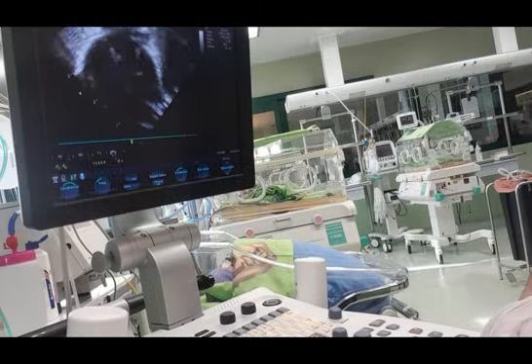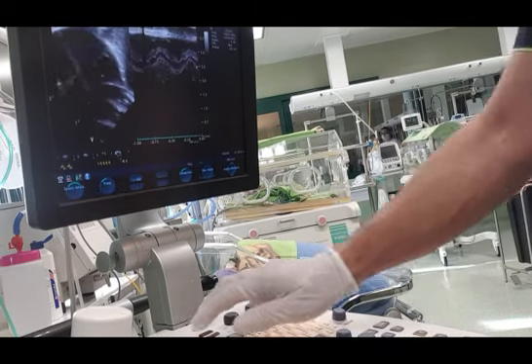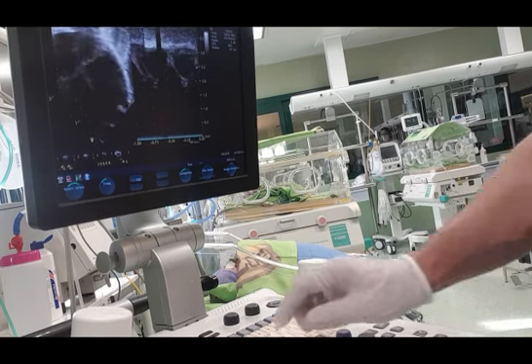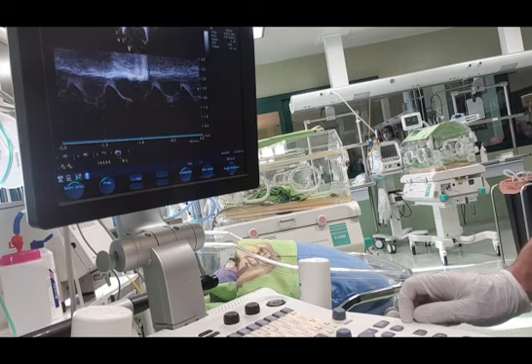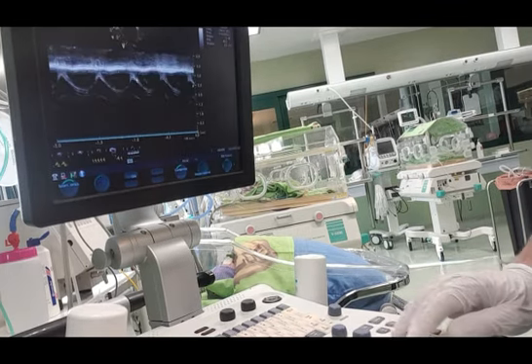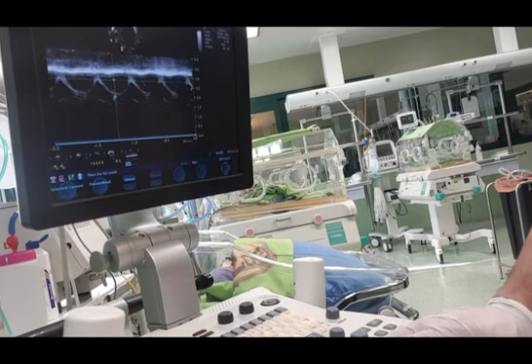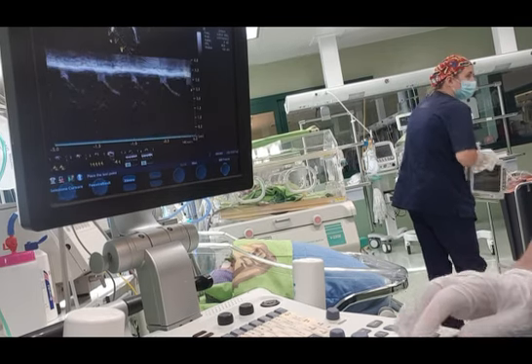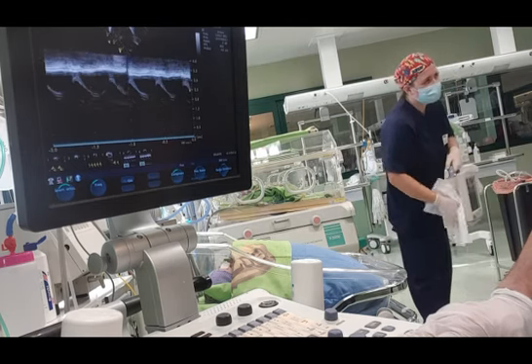Tricuspid annular plane systolic excursion is a measure of right ventricle longitudinal function, obtained from the 4 chamber view using M-mode, with the cursor aligned along the direction of the lateral annulus. It provides useful information about longitudinal fiber shortening and has shown good correlation with techniques estimating right ventricle global systolic function. Tricuspid annular plane systolic excursion is not influenced by heart rate, which is of importance for its use in preterm infants.